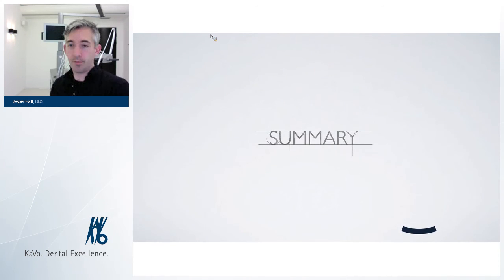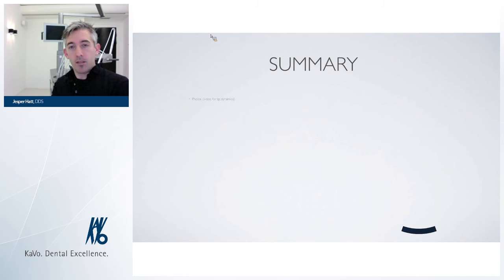So, in summary, we've been looking at the importance of photos to do our planning ahead of time, ahead of insertion of the implants, which is really important if we want to make some kind of facial aesthetic result.